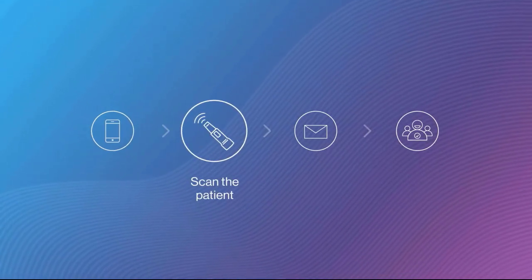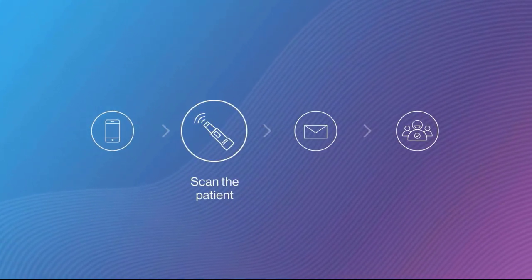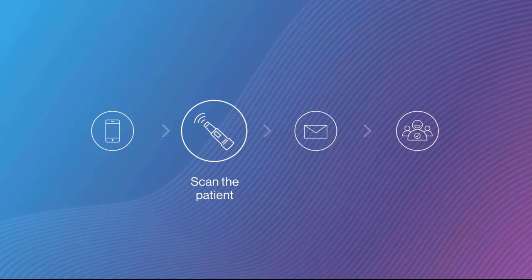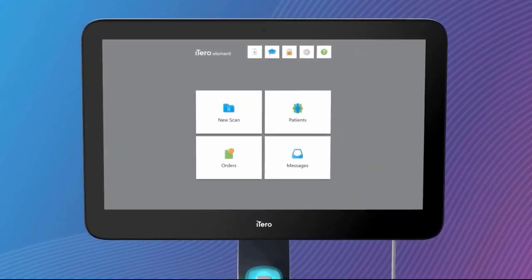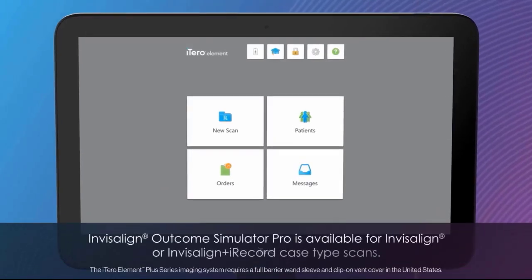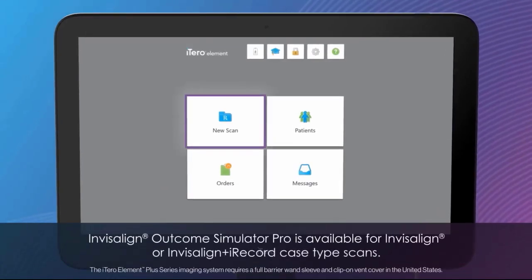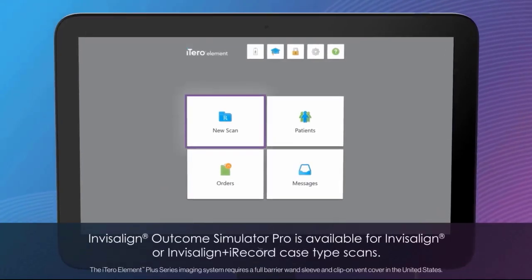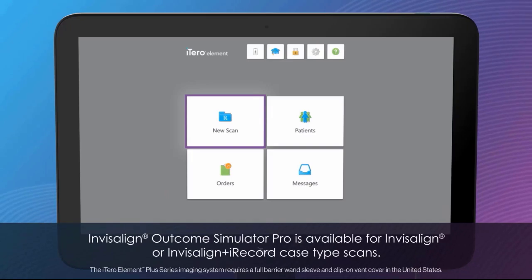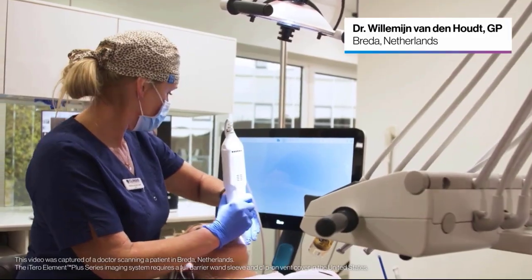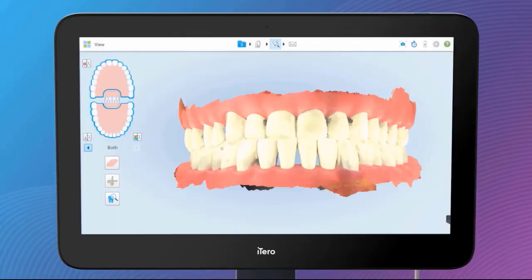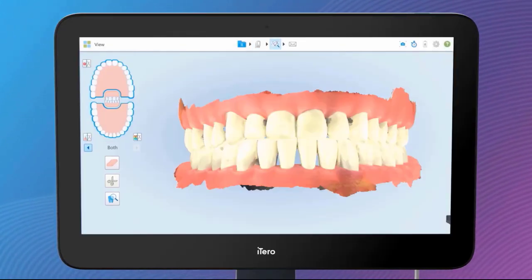The second step is to scan the patient. Log in to your scanner account and start a new scan. Alternatively, if you already have a scan, you can open it directly from the scanner or through the myitero.com portal to run the simulation. Scan the patient. Tap the View Tool button and review the scan for any holes.